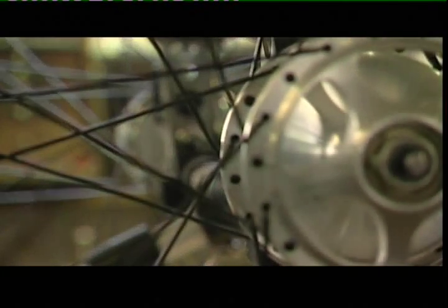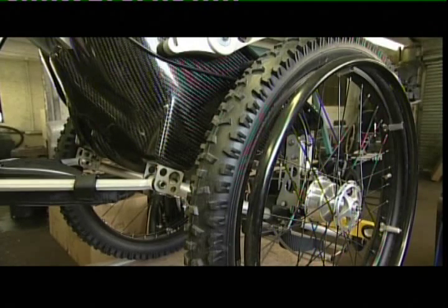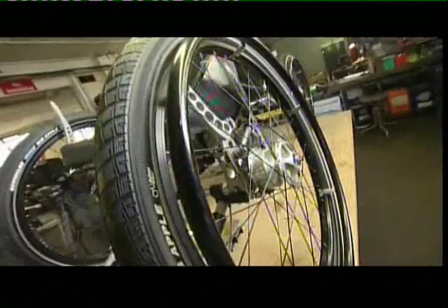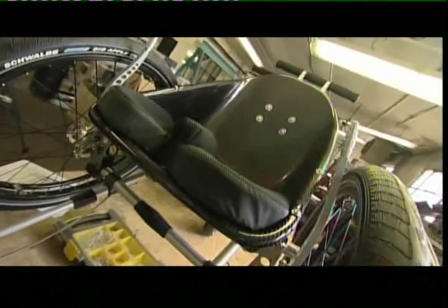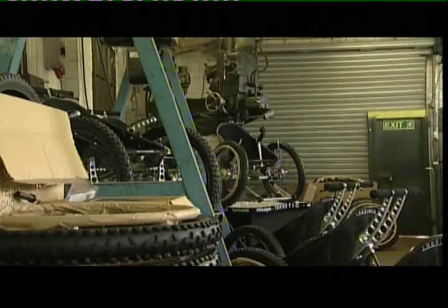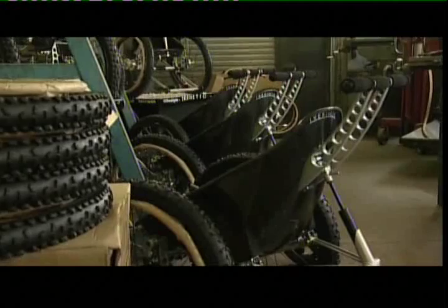In 2003, Mike finally felt the TREKINETIC was ready to unveil. He invited a group of wheelchair users to the Aspire Centre in Stanmore to take a look. Mike's unusual three-wheel design had borrowed from Formula One technology to create a lightweight carbon fibre monocoque seat, which was curved for comfort. Initial responses to the wheelchair were positive.